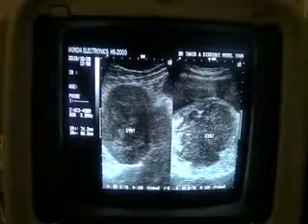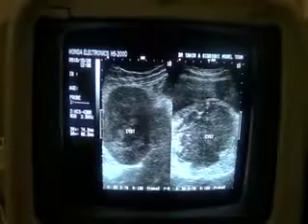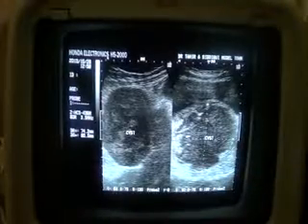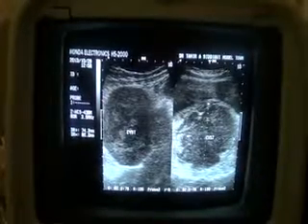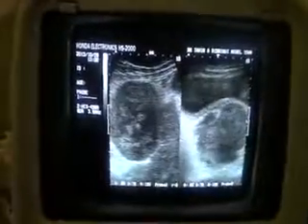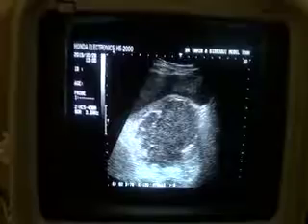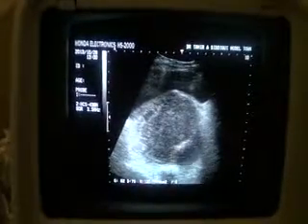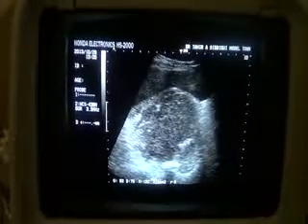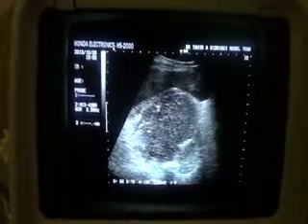The cyst has a volume of approximately more than 400 cc. The measurement 7.4 by 8.0 centimeter is the measurement of this left-sided cyst. The patient is very tender towards the left side and is not tender on the right side. You can see a row of calcified areas in the dependent region apart from these tiny calcified areas.